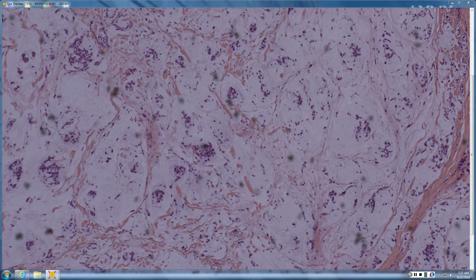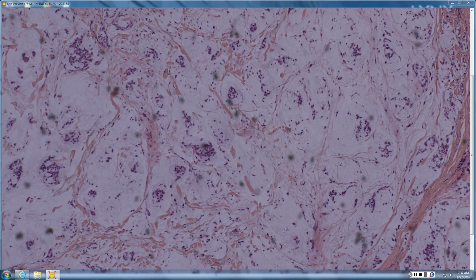Mucinous carcinoma, correct. So, mucinous carcinoma of skin looks just like mucinous carcinoma of breast or mucinous carcinoma of GI tract. They look very similar. There's some immunostaining differences for the GI ones. They're CDX2 positive, like a GI cancer, unless they're rectal in origin. But the breast and sweat gland derived ones are pretty much identical in staining because breast is a modified sweat gland. So the patients definitely all need a workup.